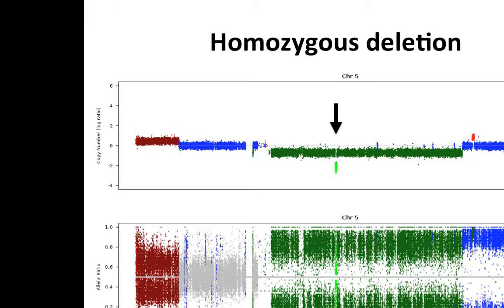What's important here is that you can see a diploid region in blue right on the zero line that has maintained its heterozygosity, whereas another diploid region is homozygous. These have very different consequences if you had a mutation in those two different regions.